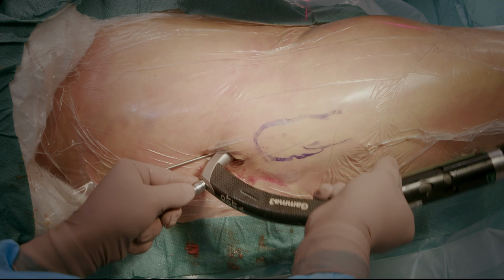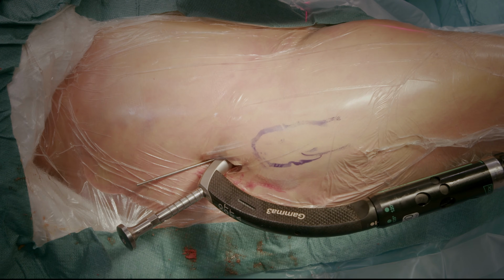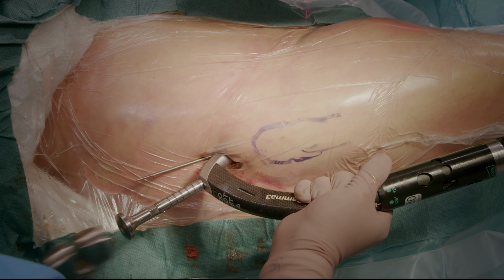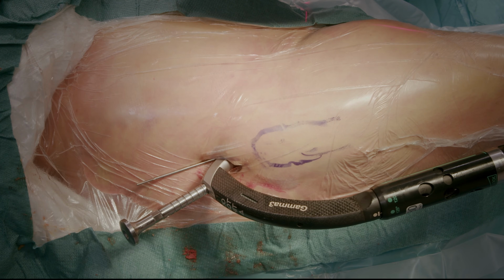It is inserted with gentle rotation. Rotating too vigorously may cause fracture dislocation. To avoid dislocation, it's safer just to tap gently with the mallet. In this way, the fracture is not subjected to any twisting forces.